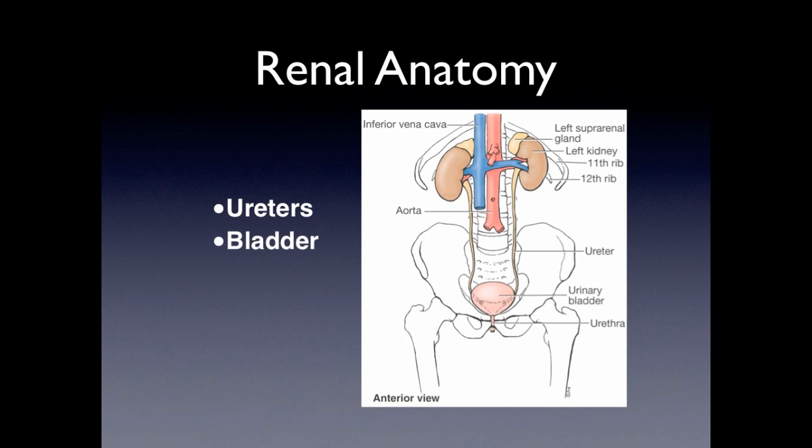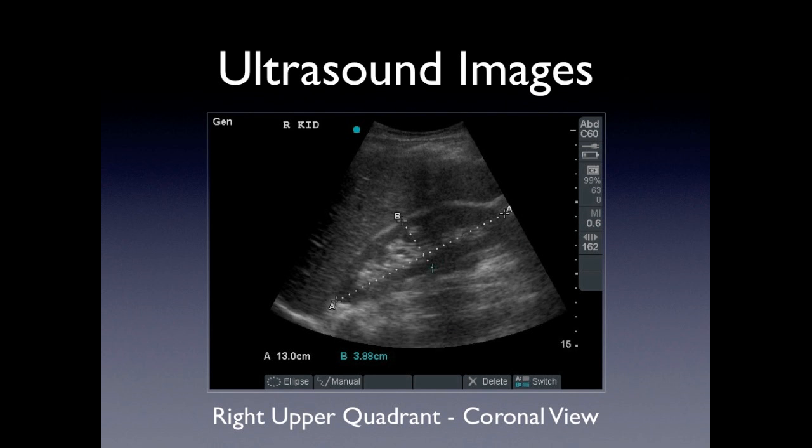Part of the renal anatomy must include the ureters and the bladder. In this image, we see a normal kidney measuring 13 centimeters by 3.8.